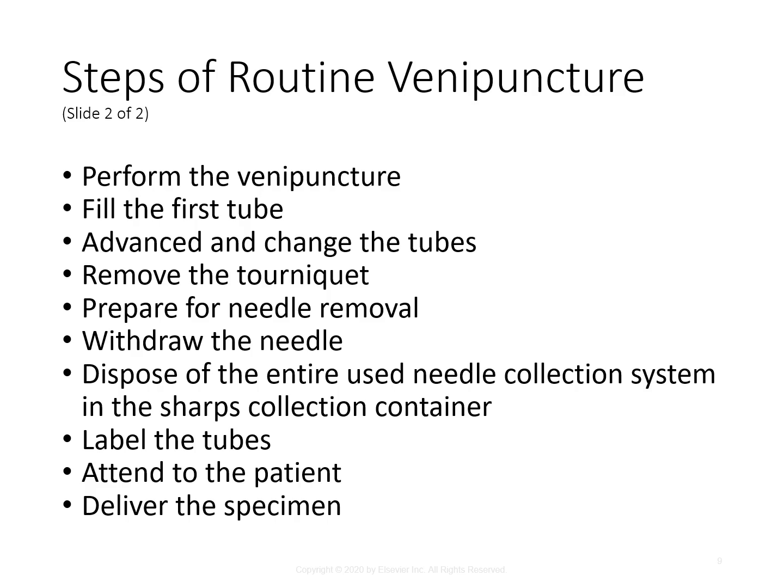You're going to withdraw that needle, and you're going to dispose of the entire used needle collection system in the sharps collection container. You're going to label the tubes with the patient still in the room. Lots of times they want you to also have the patient look at the labels on the tube as well to verify that that is them. You're going to attend to the patient, see if they need anything else, and then you're going to deliver the specimen to the laboratory.